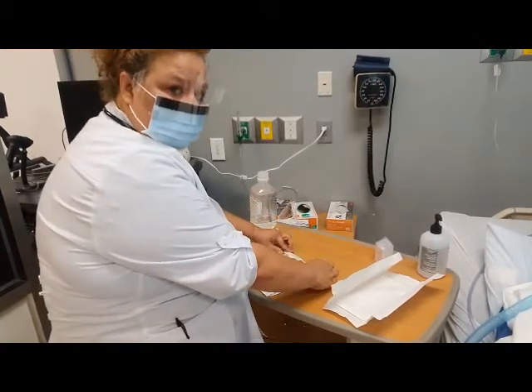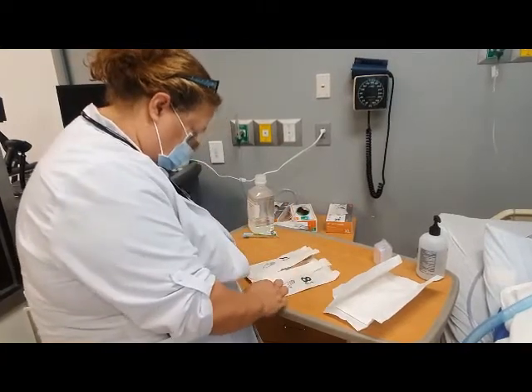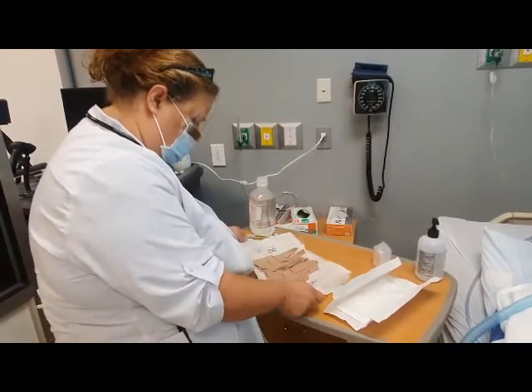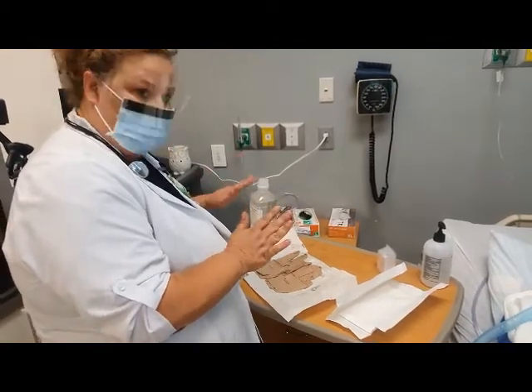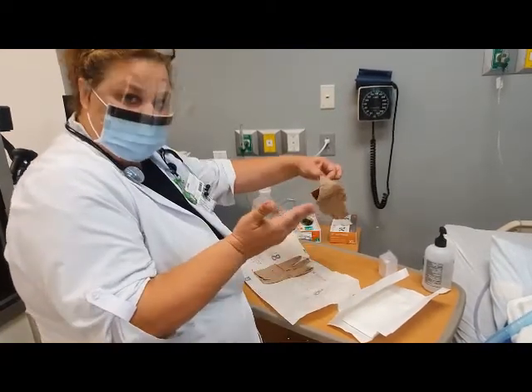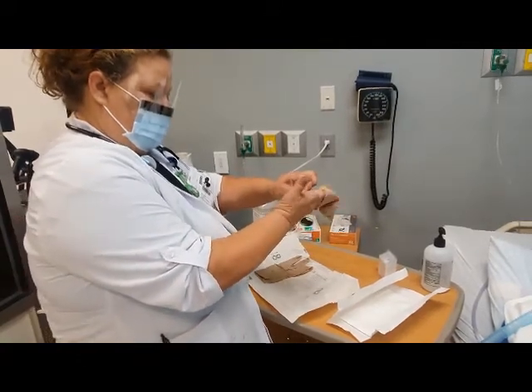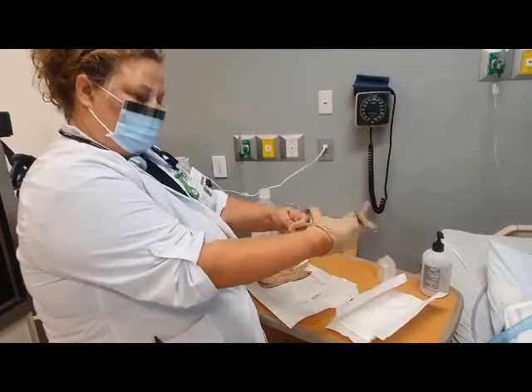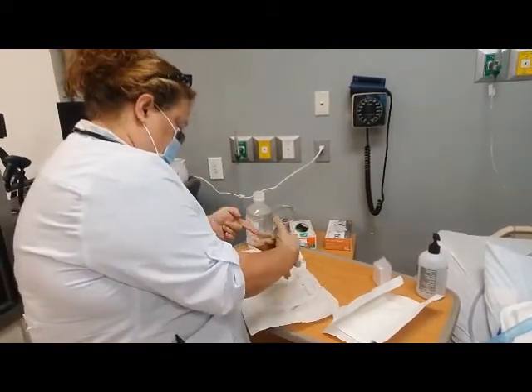Now you have the creases up here at the top. You really want to make sure that you bend them backwards, also down here at the bottom, because when you open it up, it won't flop back on you, so you won't have a contamination. Now, when you're putting on gloves, you touch right here on the outside and put your hand in so as not to contaminate. If the glove doesn't go on right, you can fix it in just a minute. Slide through the other side.